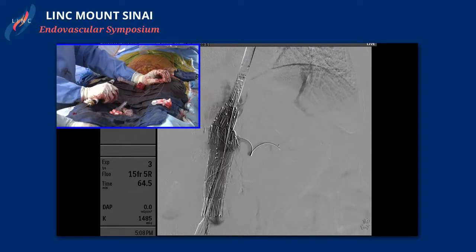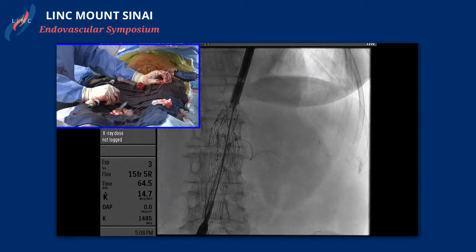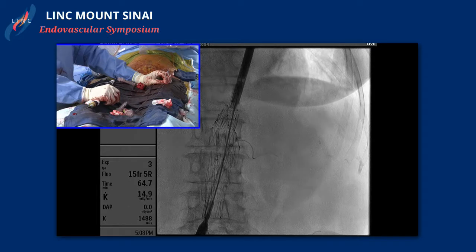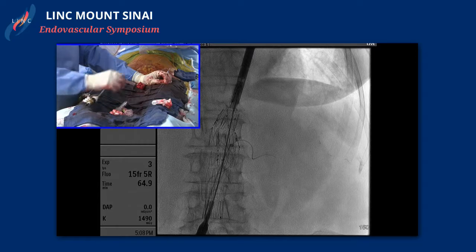Let's go ahead and walk this trailblazer out and come back with it. Do we ever find that angle trailblazer? Quick cross — we've got it on the west side. Jim, we have one more talk to go. I wonder if maybe we'll do the next talk and we'll still have about a minute and a half, two minutes to see your completion. If not, I'll bring you films tomorrow. Sounds good.